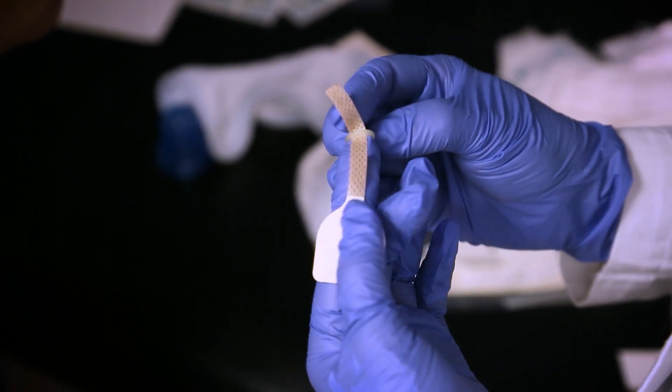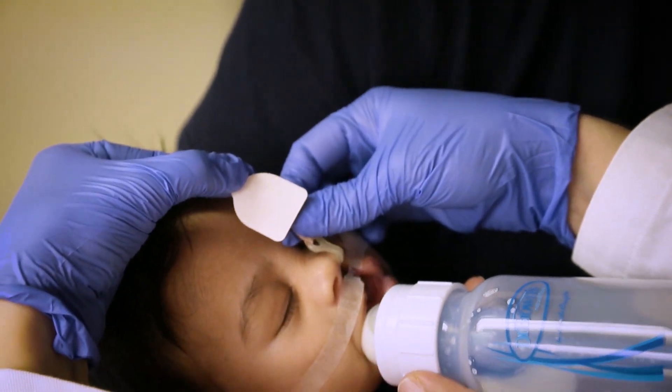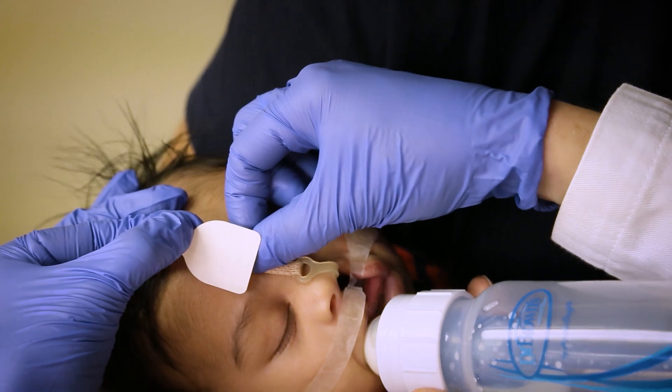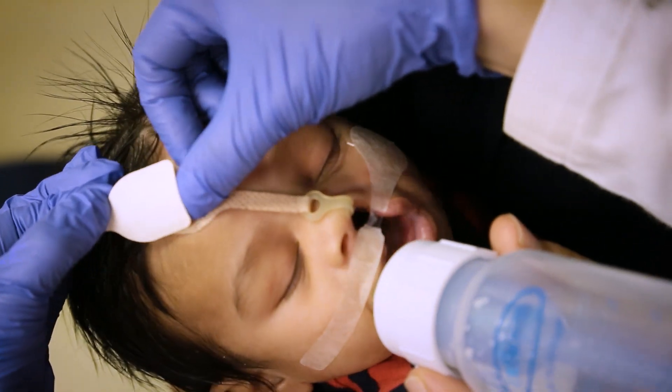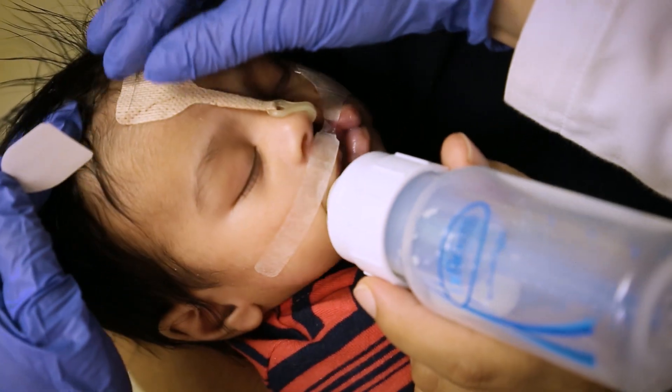Dry the forehead with alcohol, place the nasal stent into position, and gently lift to activate the elastic, then tape to the forehead. We'll show you the proper angulation, as this does change based on the shape and severity of the cleft. Again, this should be changed every 24 hours and kept dry. Any questions, please contact us.